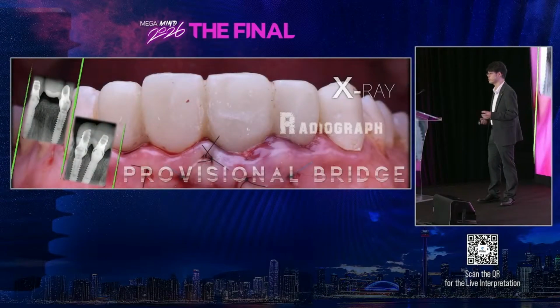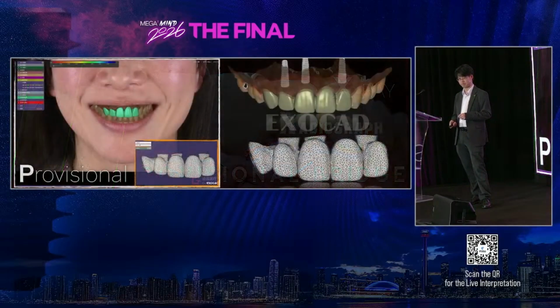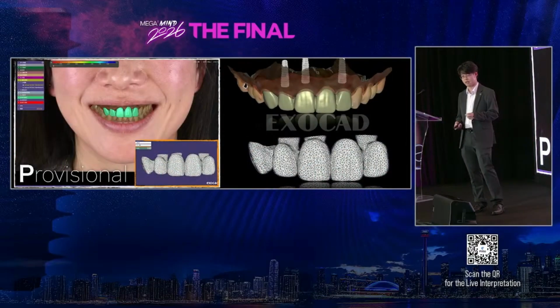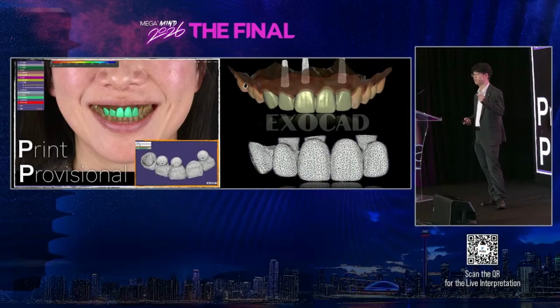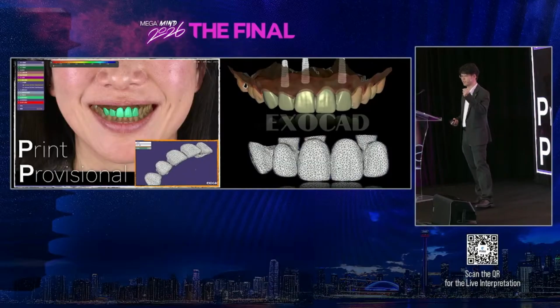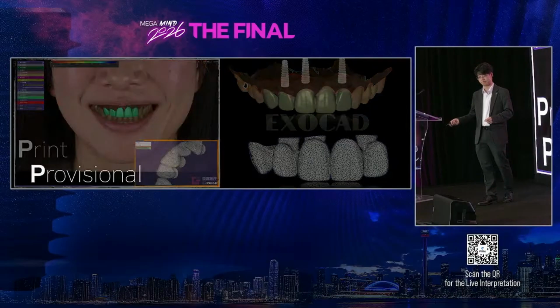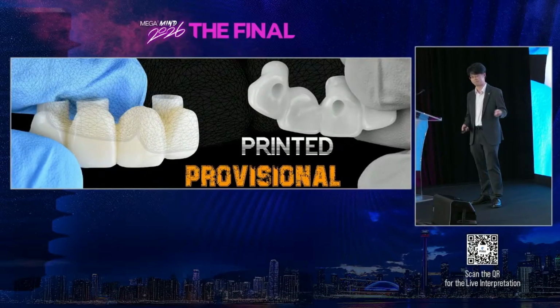And take an X-ray to check the abutment was well seated. After we place the implant, we also take an oral scan because we need a printed provisional bridge, because it is much smoother than what we did near the chair. And this is a printed provisional bridge.